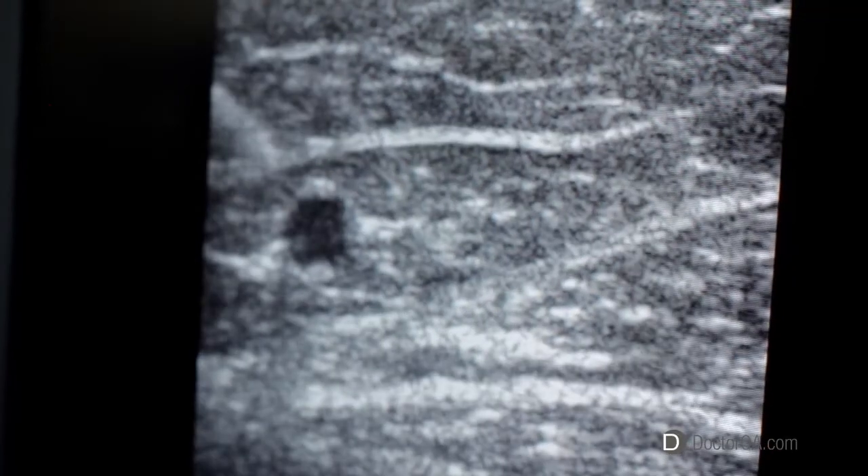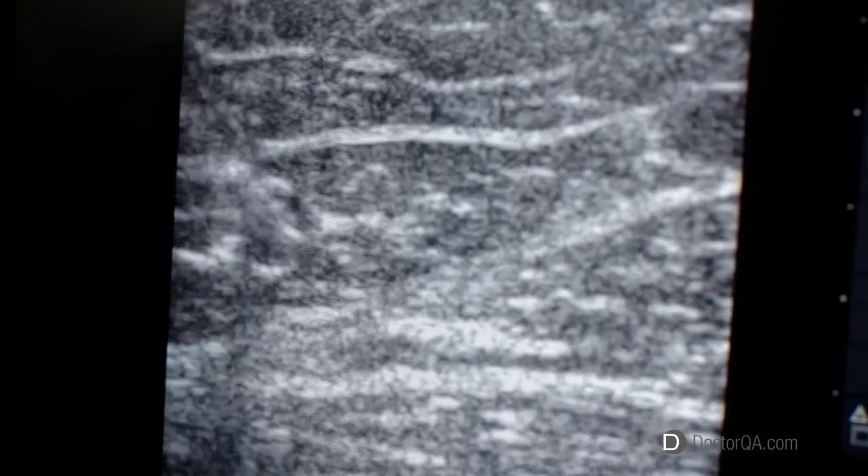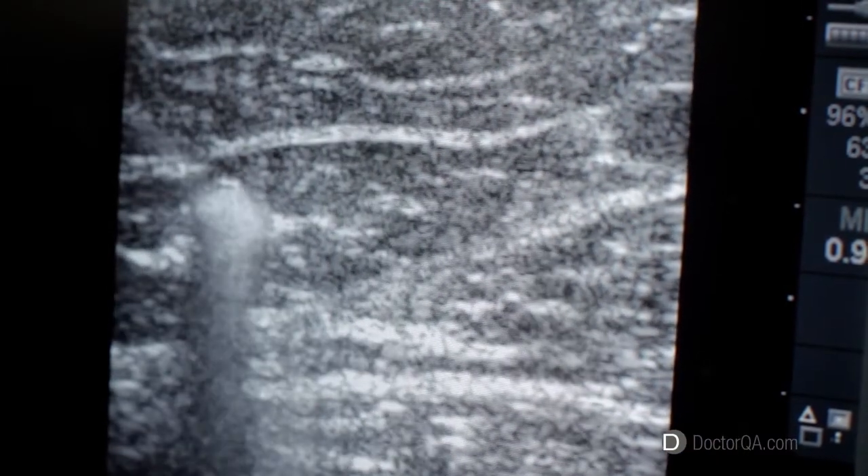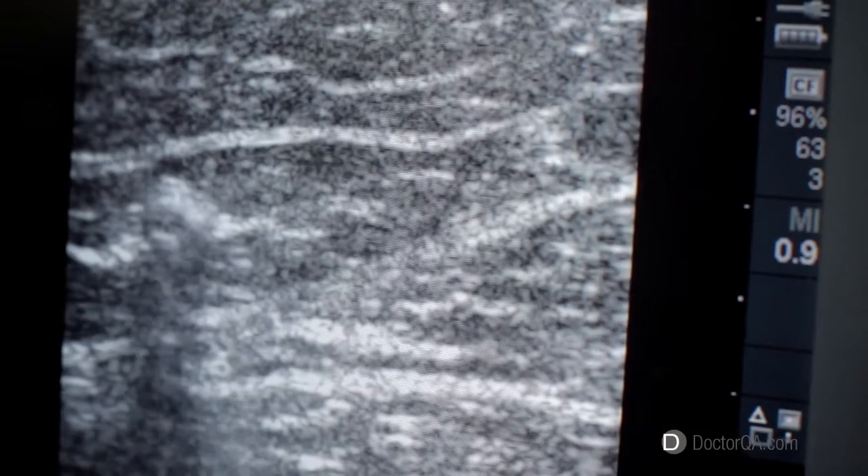The ultrasound can locate the diseased vein under the surface. The needle can then be directly seen entering the vein and the sclerosant is injected into the vein with full visualization of the direction and extent the sclerosant travels.